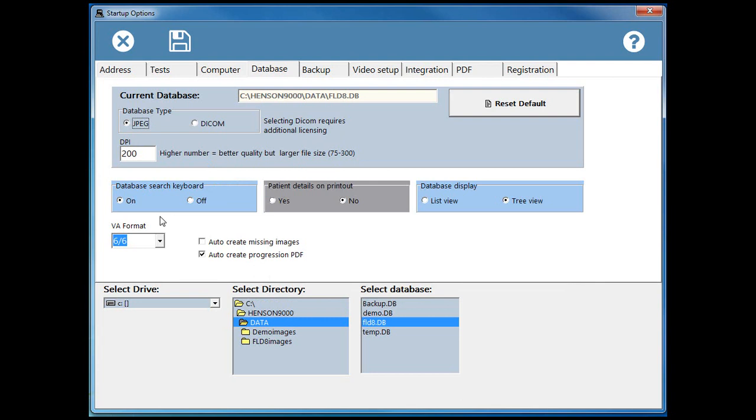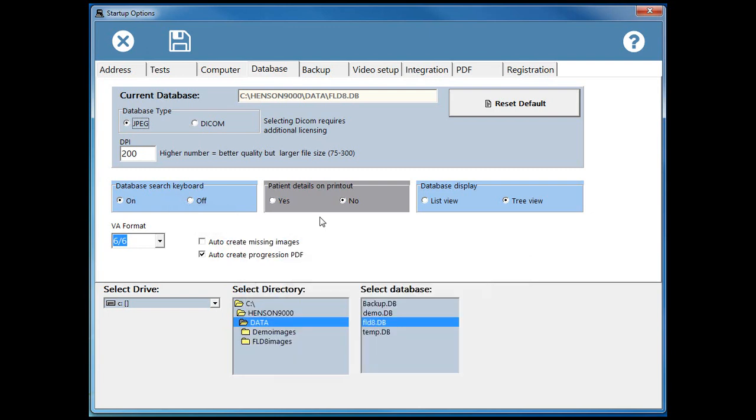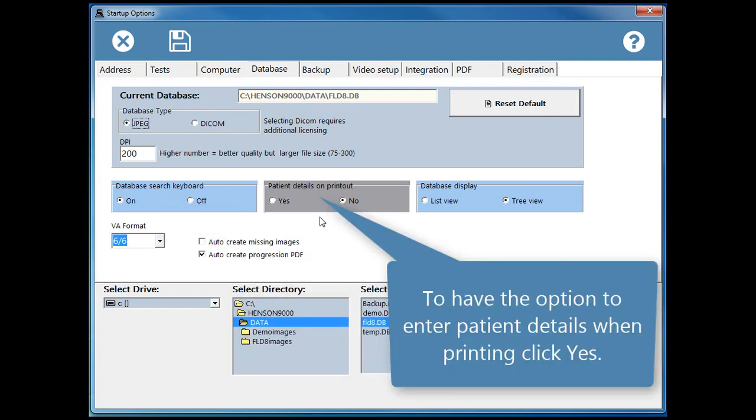For touch screen users, a keyboard can appear when the database search is pressed. To have the option to enter patient details when printing, click Yes.